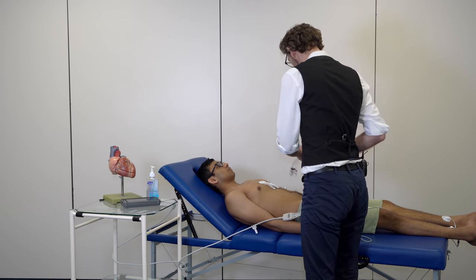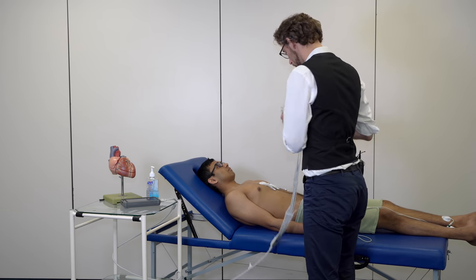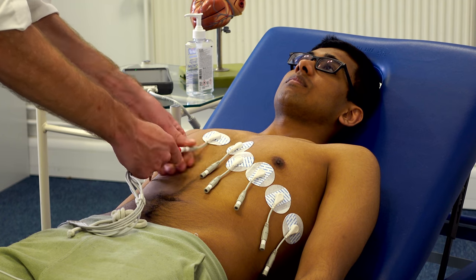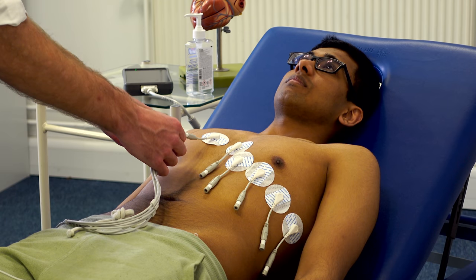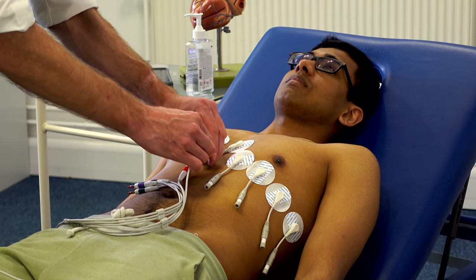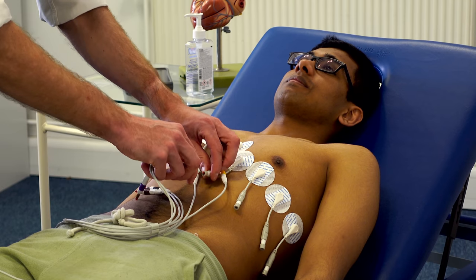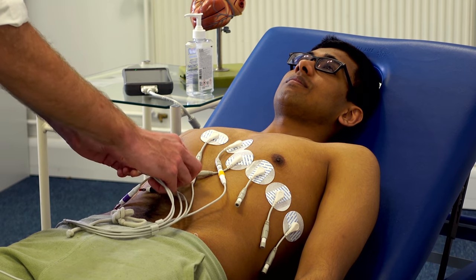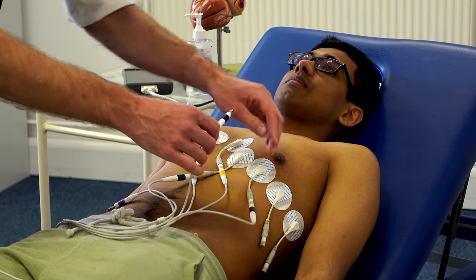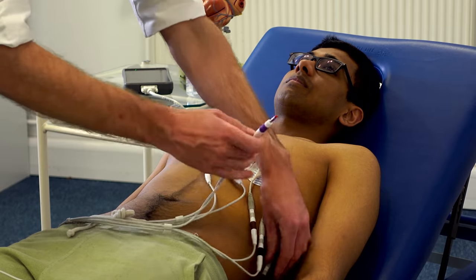We then apply our chest leads, which are colour coded but also numbered. We start with V1, then V2, V3, V4, V5, and V6.